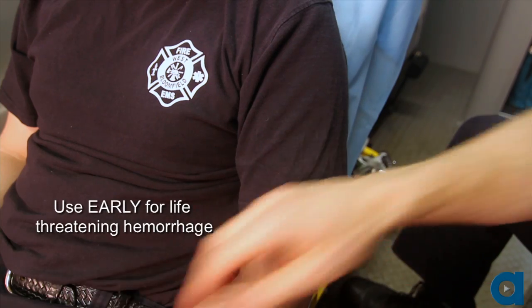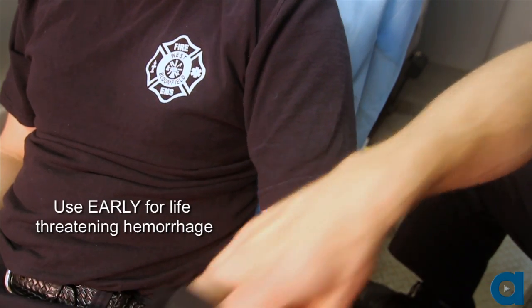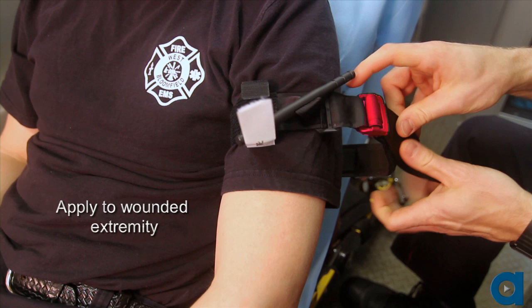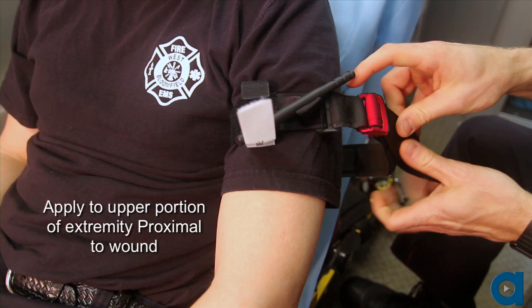When using the CAT, consider the following steps. Ensure the tourniquet is used without delay for life-threatening hemorrhage. Insert the wounded extremity through the loop of the self-adhering band. Apply the tourniquet to the upper portion of the extremity proximal to the wound, over the clothing.